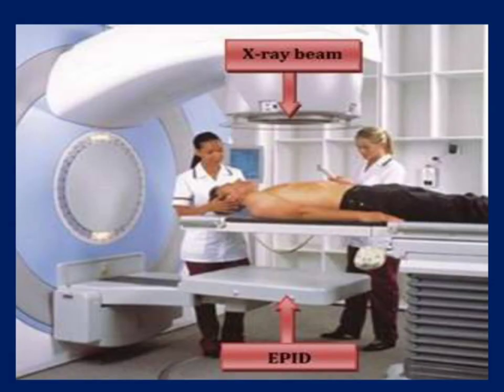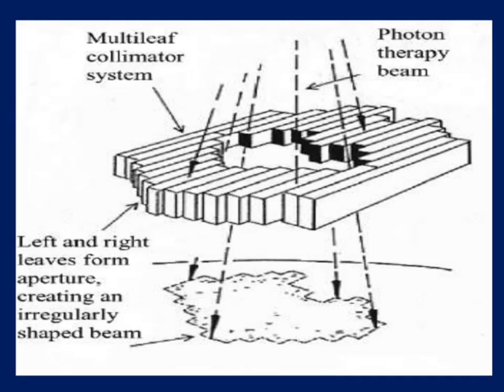There are also subatomic particles like electrons, protons, neutrons and alpha particles. These are called particulate radiations. The linear accelerator generates electrons as well, and cyclotrons generate the protons. So as of now, we have electron treatment and proton treatment. Though work has been done on neutrons and alpha particles as well, for clinical use electron therapy is the most used globally, and now proton treatment has been added.